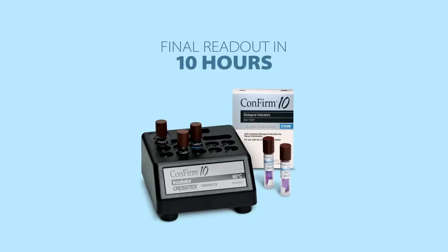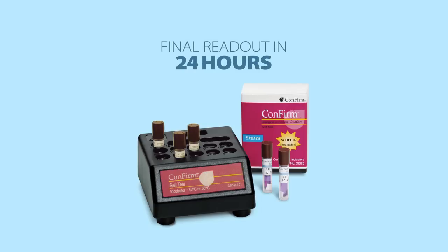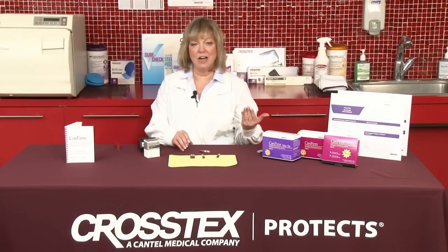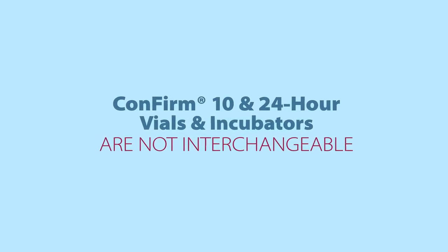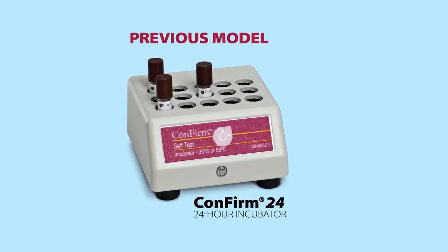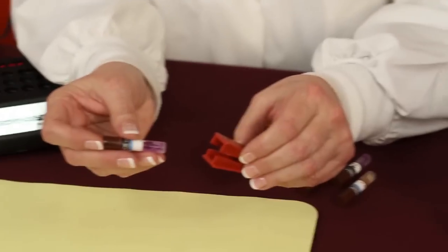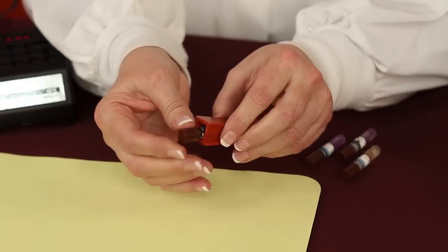With a Confirm 10, you're going to be able to do a 10-hour incubation for your final readout. Some of you may have what we call the Confirm 24, and that is a 24-hour incubation product. A Confirm 10 vial needs to be used with a Confirm 10 incubator. A Confirm 24-hour vial needs to be used with a Confirm 24-hour incubator — they are not interchangeable. If you do have one of our previous incubators and you are using a Confirm 24-hour product, that product does not have a built-in crusher, so there's actually a supplemental crusher. It's just plastic, and you simply place the vial inside and squeeze down, and that will crush the inner ampule.